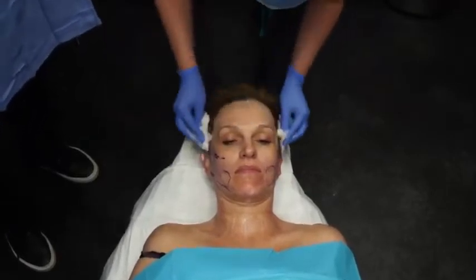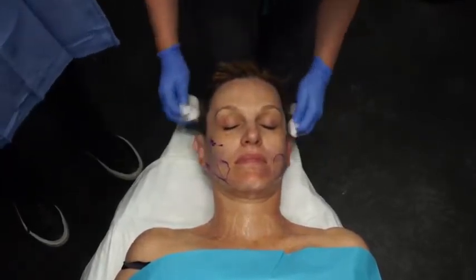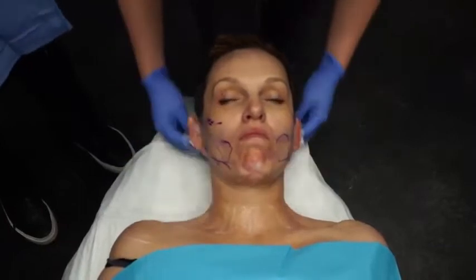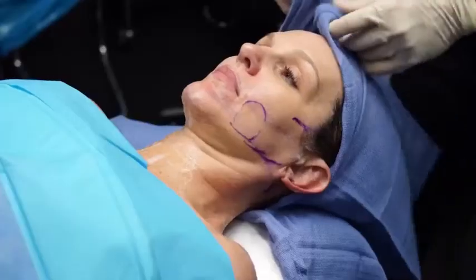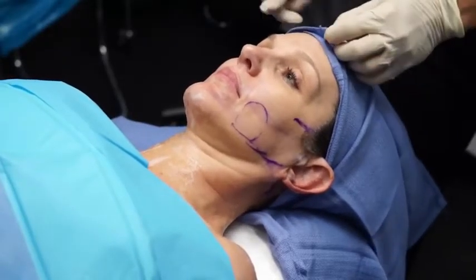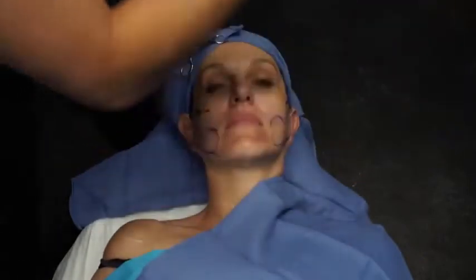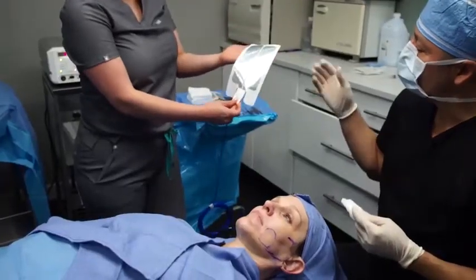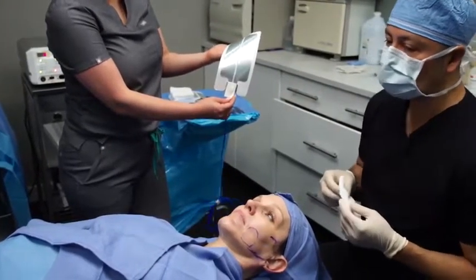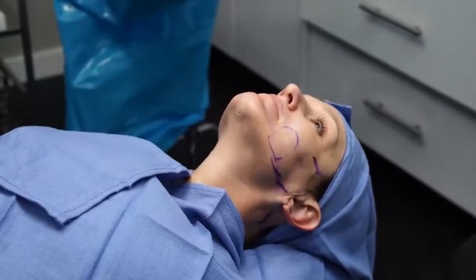Good. And we'll go ahead and lean her back. You can use betadine or Hibiclens or really any skin prep to make sure that you maintain as much sterility as possible. And then we have these preset kits with sterile surgical towels that we'll use to drape the patient. This is the split pad, the grounding pad for the Renuvion unit, which you need to attach for every case.